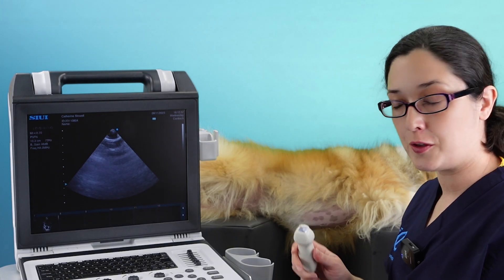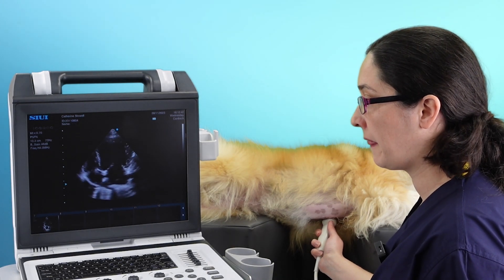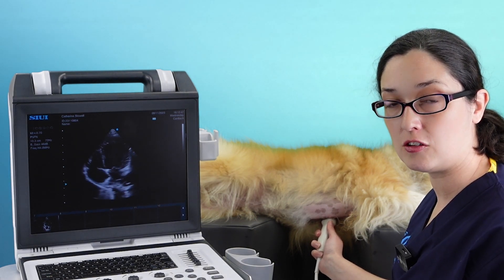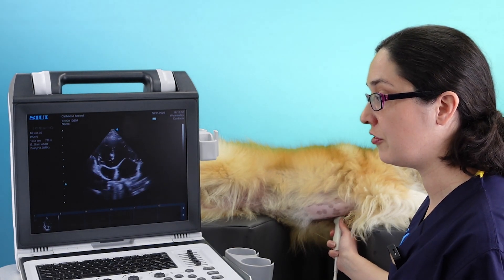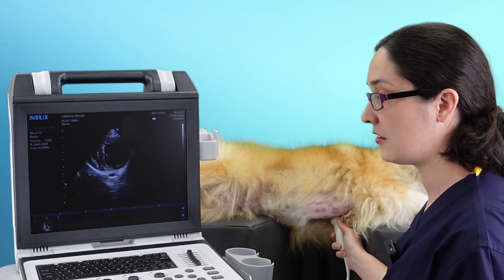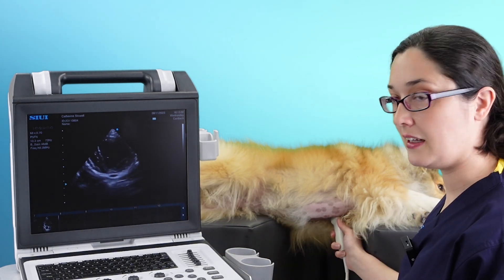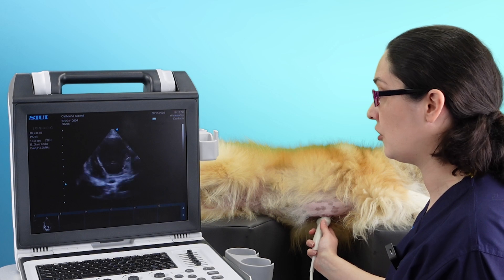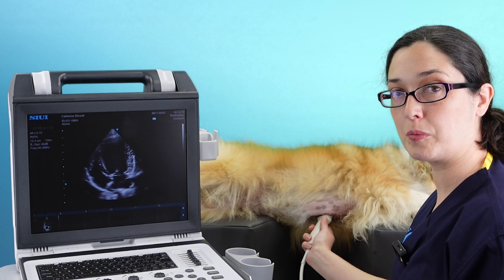First of all, we need to get our four chamber view with our marker towards the patient. Place it on their chest, and you want to make sure you're as apical as possible. Remember, you cannot be too apical — you'll fall off the end of the heart and lose your image completely. You can definitely be too far towards the base. So if your image shows only two chambers, you need to lift the tail of your probe, bringing the atria into view, and then slide down as far as you can so that you're stretching out the ventricle to be as long as possible.